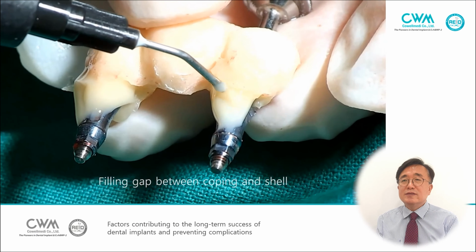At chair side, this emergence profile is made, and the screw hole is maintained, and polishing and trying.